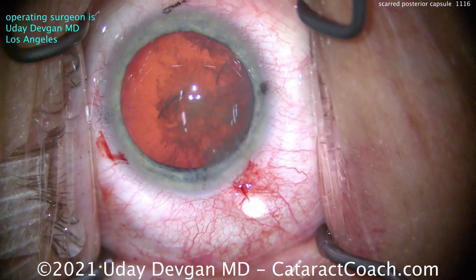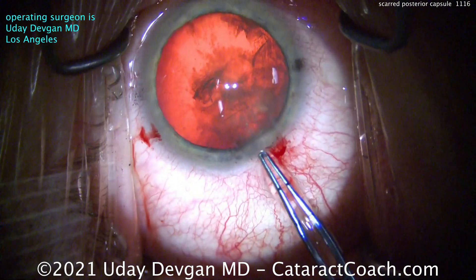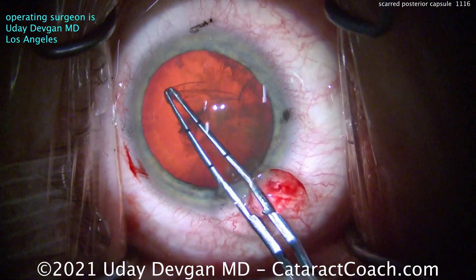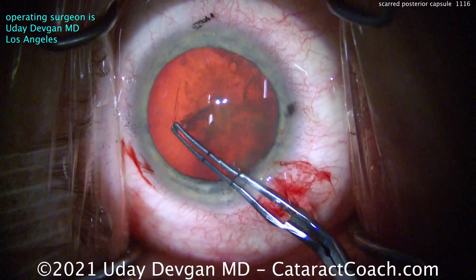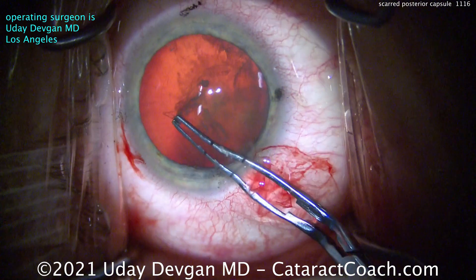Adjusting the scope lighting — there we go — using more coaxial illumination in order to see that rhexis. My view through the microscope is much better than this high definition video, so we are able to see it quite well. You can see the edge of it, and we end up with a beautiful capsular rhexis. That goes great.